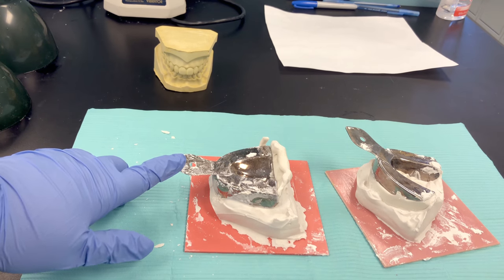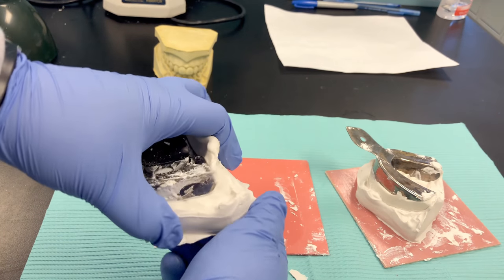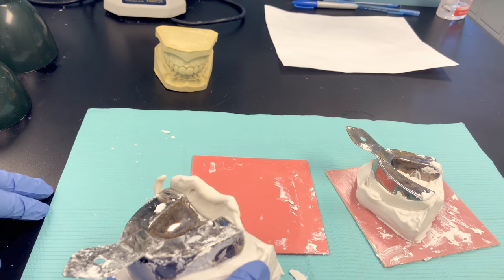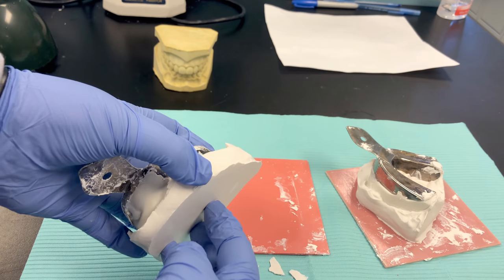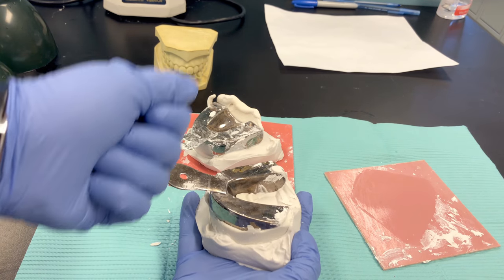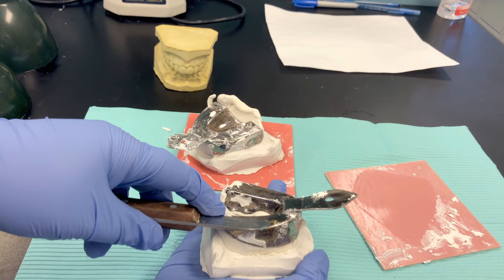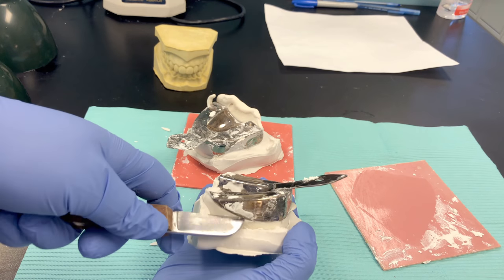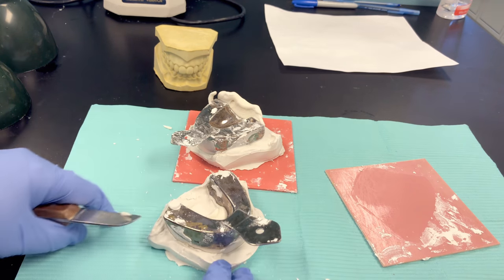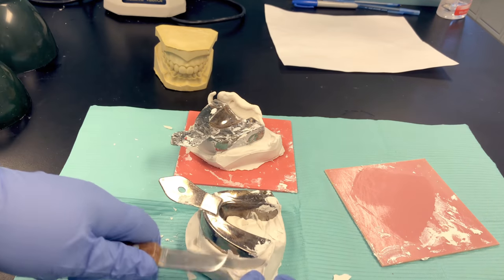We've given our models enough time to harden — they've gone through their setting process. Gypsum products go through an exothermic reaction, so don't be surprised if your model gets warm and starts to sweat. You'll feel moisture come out of your stone. What I find as the safest way to remove these is to lift as straight up as possible. You'll have to start the separation process — I like to do that with a laboratory knife, putting the point under the tray and giving it a twist up.